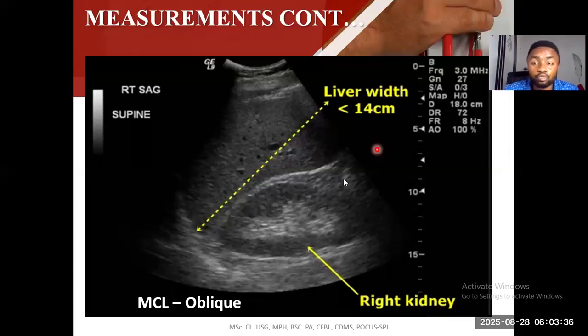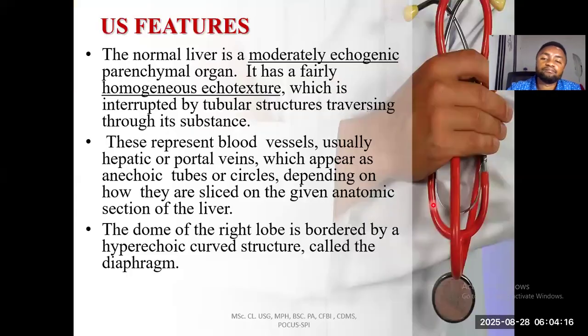Do you understand? So we have some variations, but it's good that you capture the liver, letting the kidney show. Not that the kidney should be fully seen all the time, but at least part of it must be seen so that you can label this as the kidney. Once you label the liver, you can just say kidney. It's not needed to say right kidney, because we know that the liver is on the right side. Or you can decide to also write right kidney. It's all fine.